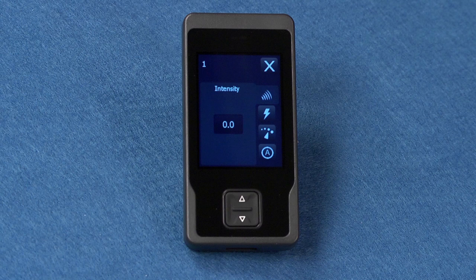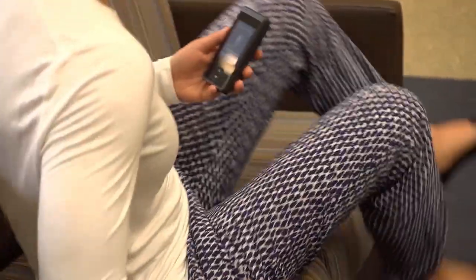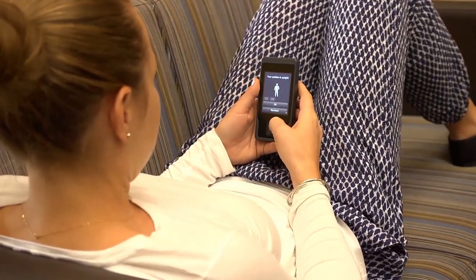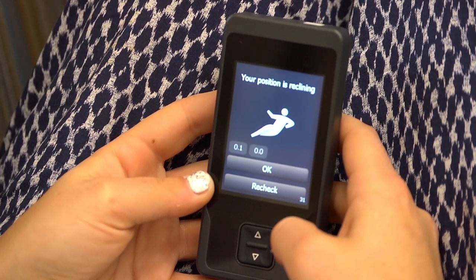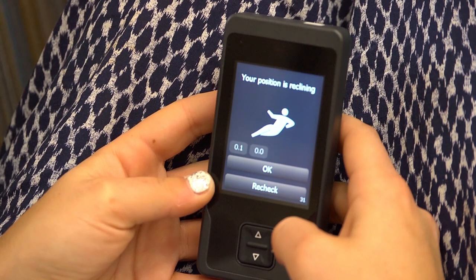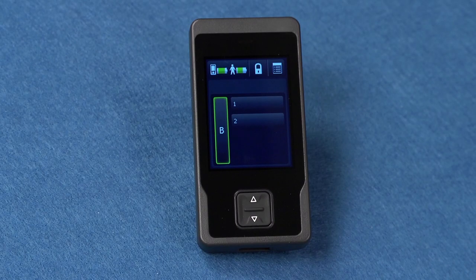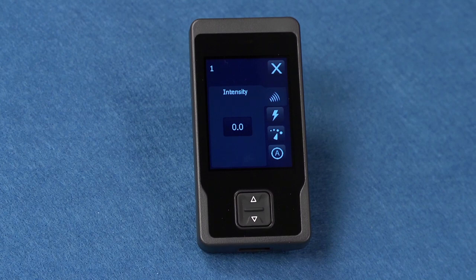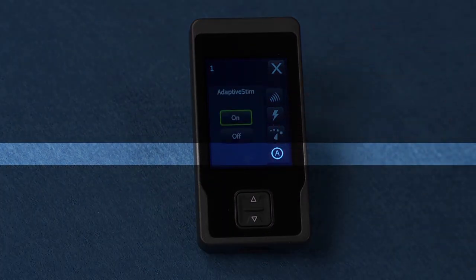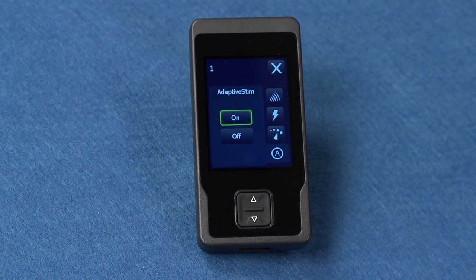Now let's talk about adaptive stimulation. When adaptive stim is turned on, the neurostimulator can automatically sense your body position and adjust the stimulation based on your position. The adaptive stim feature must be turned on to view or change adaptive stim settings. To turn adaptive stim on or off, press a program button on the home screen for the program you want to adjust. When you turn adaptive stim on or off for one program, it will be on or off for all the programs. You can make adjustments to adaptive stim to change intensity settings for a specific position.